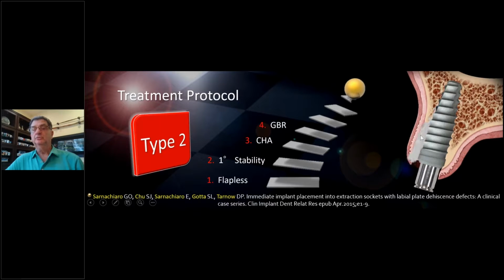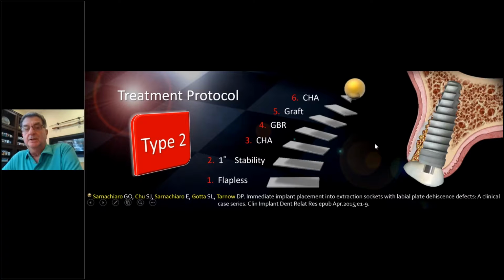You take it off, put a membrane in, then put a graft in inside. So now here's your GBR. That's like the cone part of the ice cream cone combined with the bone graft. So you graft the apical part, and then you have the custom healing abutment. You put the custom healing abutment back on, and it socket seals the surgery, keeps the shape of the tissue open, and allows you to graft that whole buccal area later. That's the combination of type 1 and type 2 ice cream cone combined with type 1 surgery.